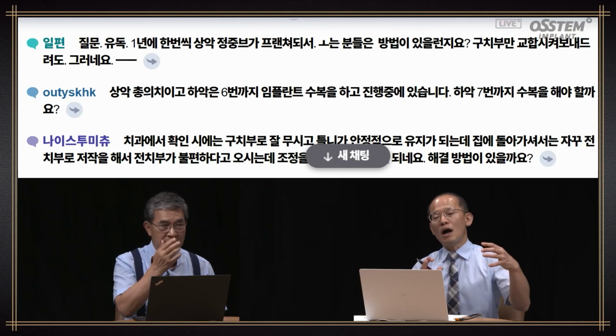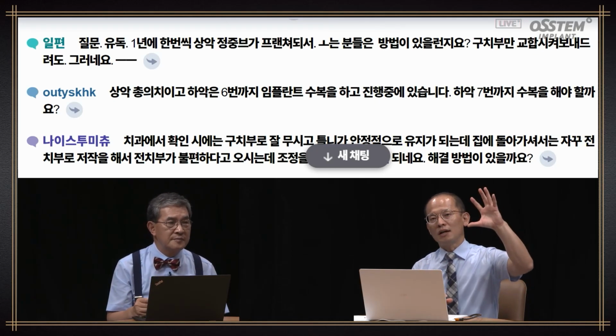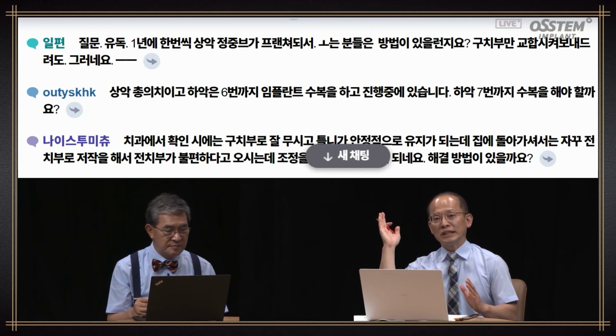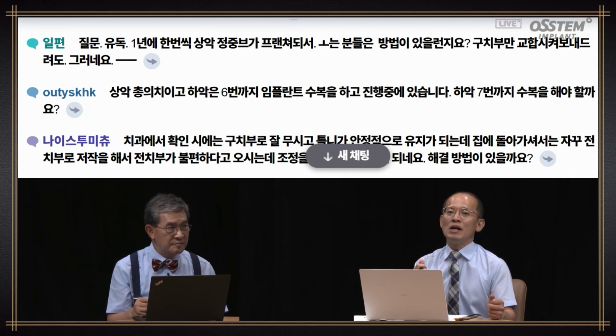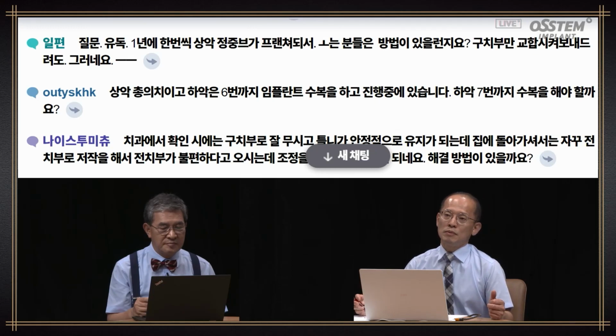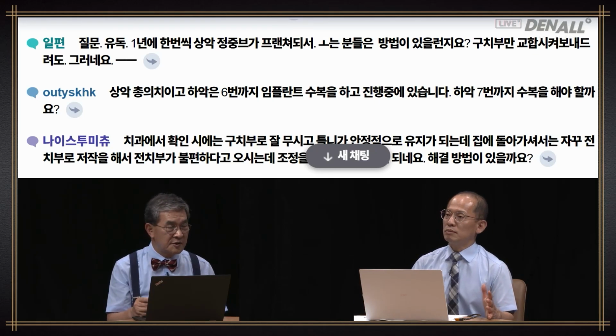You see this frequently with a lower implant and an upper full denture. It's mostly angled fracture, related to occlusion on the anterior side, but here the doctor only did occlusion on the posterior side. So I think we need more information.